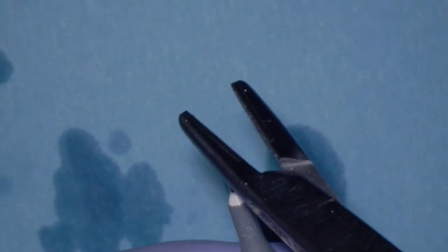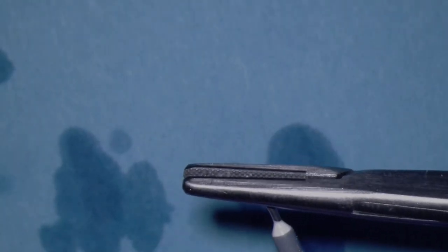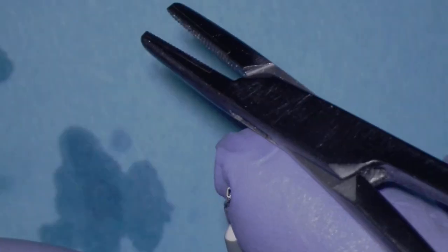Next, without the need of pre-curing the adhesive, we're going to bring in the syringe of cold flowable, and we're going to bend this syringe with the hemostat parallel to the long axis of the cannula. We're going to squeeze it so that it has a narrow tip just like this. This will allow us to have a nice thin tip to go deep into the embrasure. So that's about the right shape for the cannula.